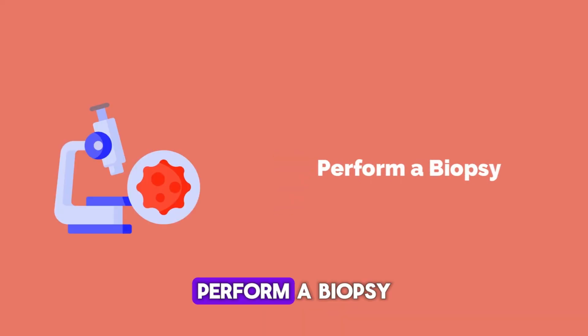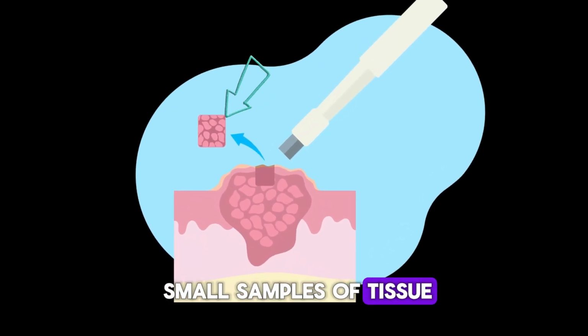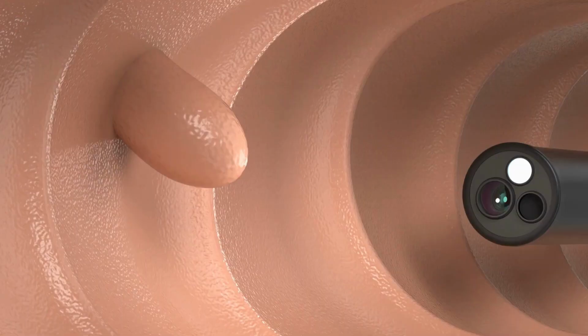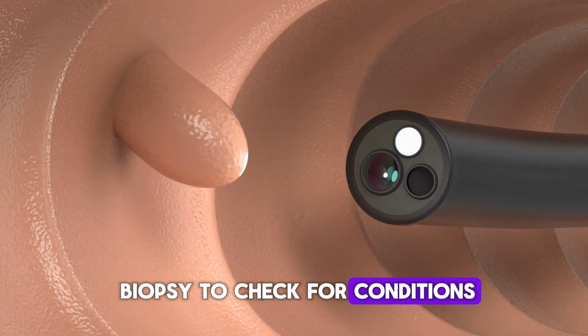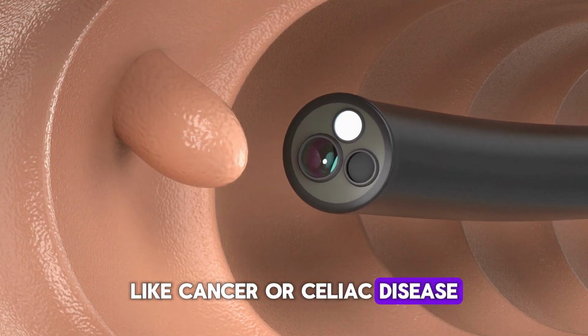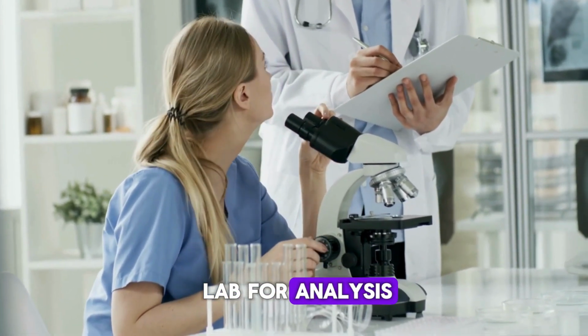7. Perform a biopsy. A biopsy involves taking small samples of tissue for further testing. During a gastroscopy, doctors can perform a biopsy to check for conditions like cancer or celiac disease. The biopsy samples are then sent to a lab for analysis.